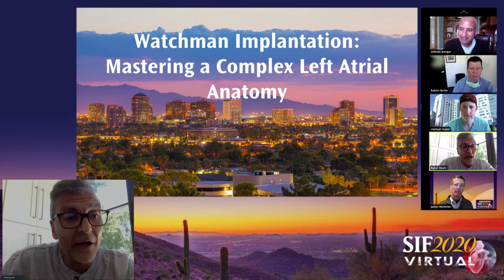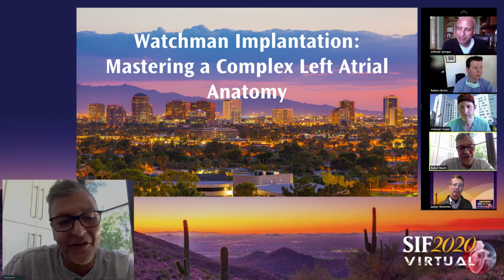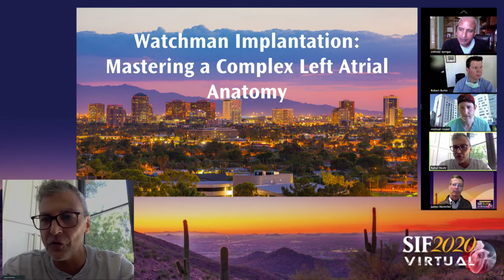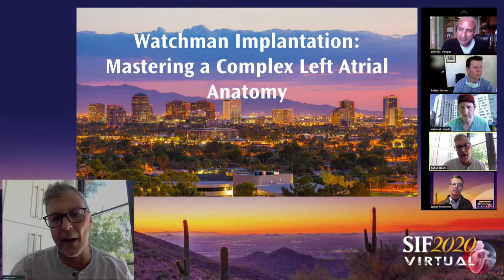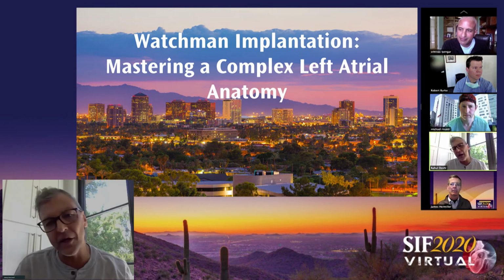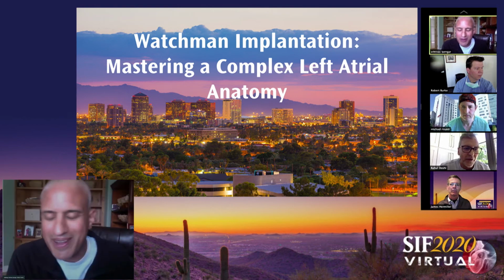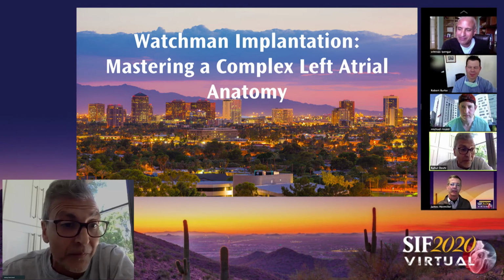I mean, I'll tell you, when I was looking at your choice and going with the 30, I am also equally amazed that Ed opened up and covered. I think it's an amazing case, actually. I do love the idea of going to a single curve with that anterior curve. That's exactly what I would have done. I was actually thinking 33, because the radial force, at least there was enough proximal depth before the lobe separation, where the radial force would still be more proximal, and you'd end up with a much bigger shoulder than what you had. So there's no doubt I would have had a lousier job. No. It's an amazing deployment, actually, for that anatomy. It's really a great job.